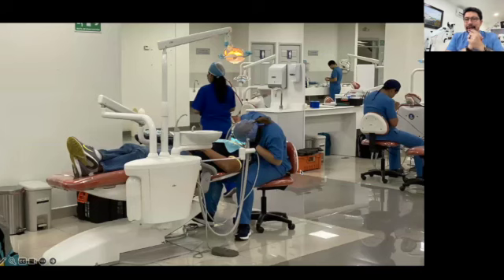But let's analyze this picture. I used to teach in the university. I taught in the university for 9 years. And this was a scenario that I had to deal with every day. And what do you think? Do you think she is enjoying dentistry? Definitely not. She's trying to see inside of the mouth of the patient.